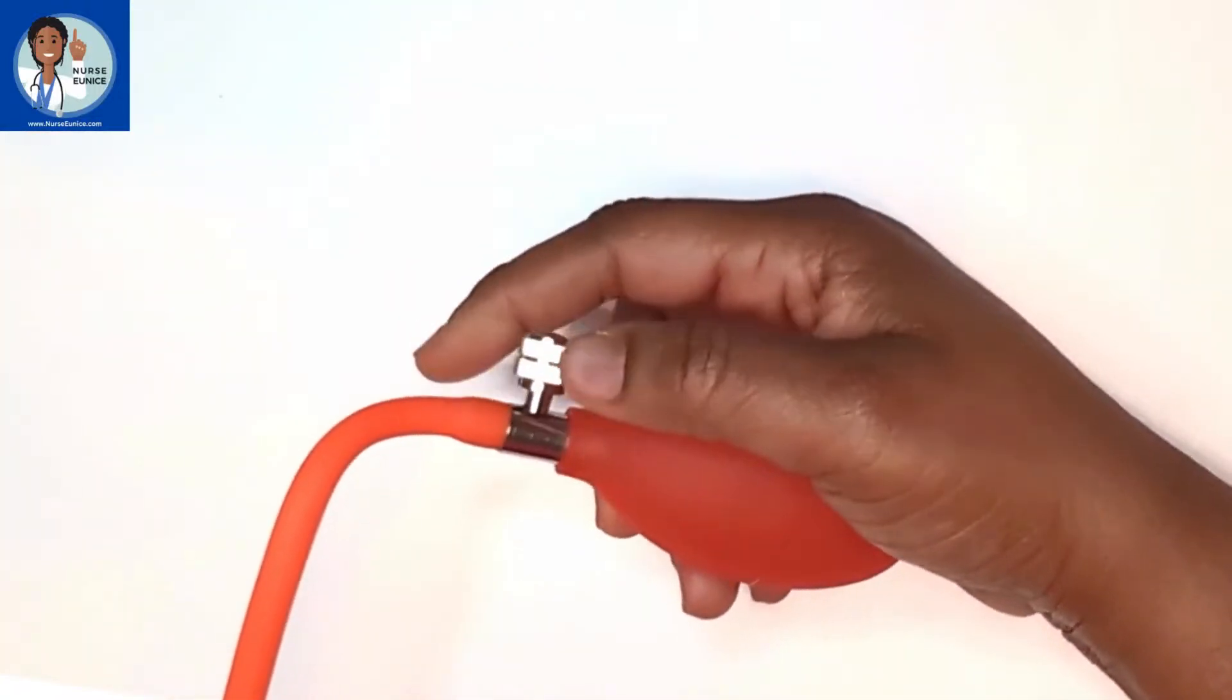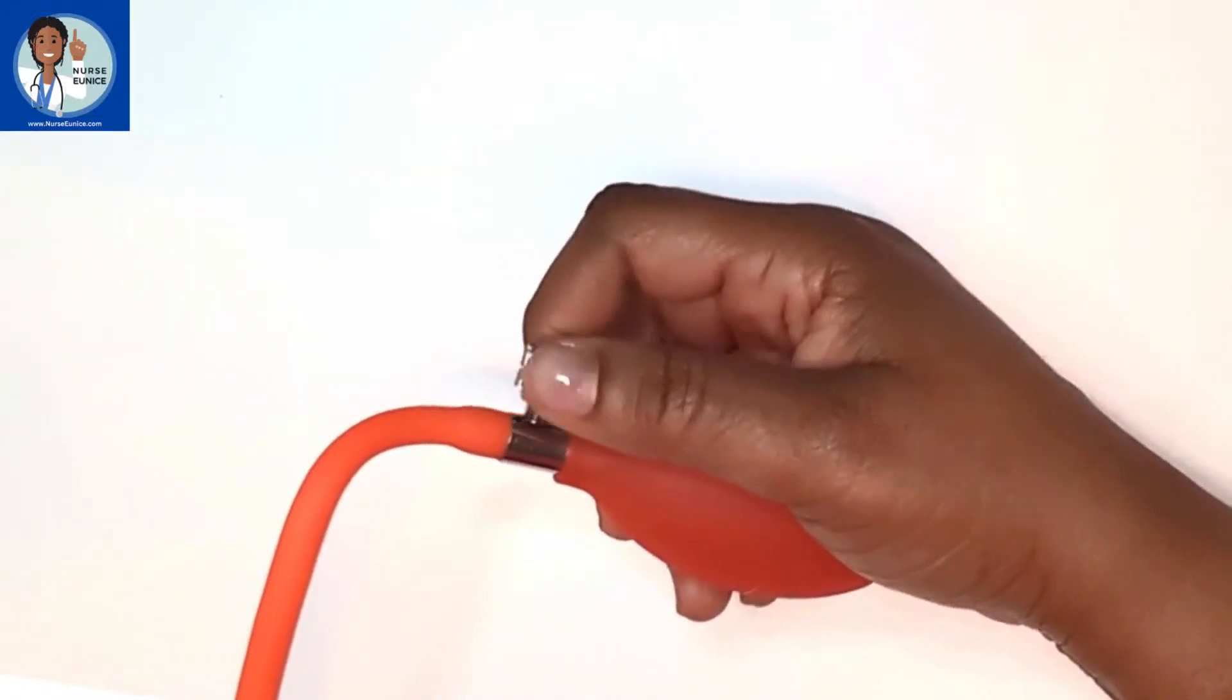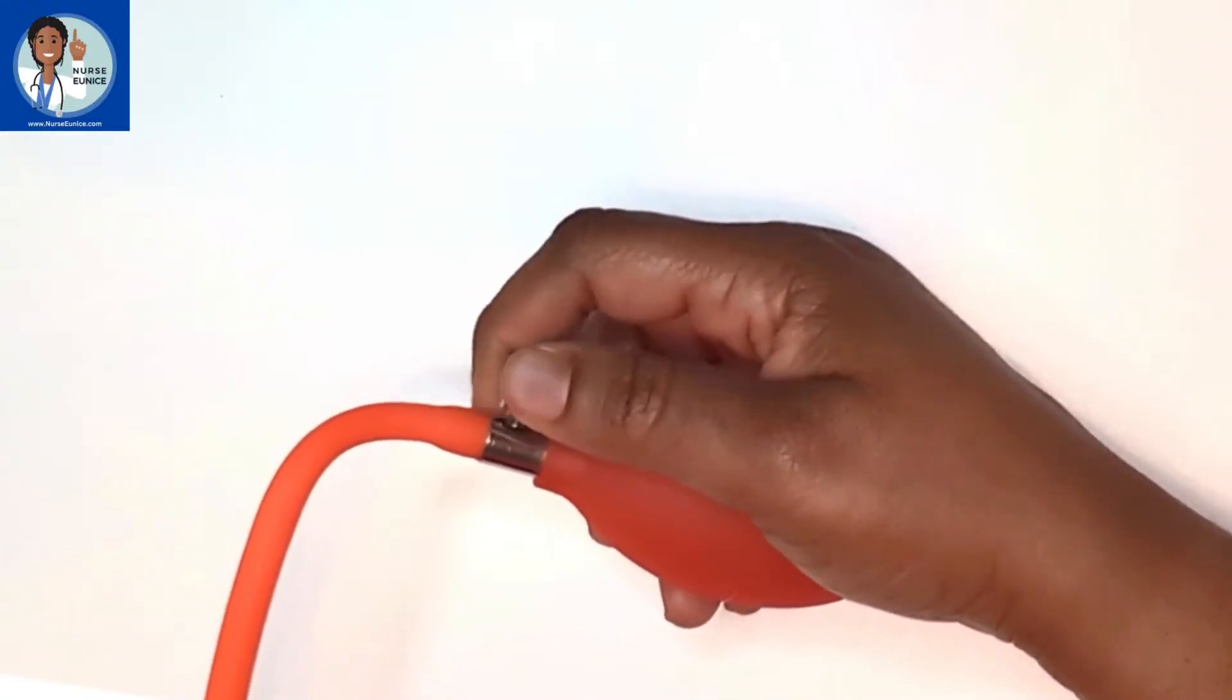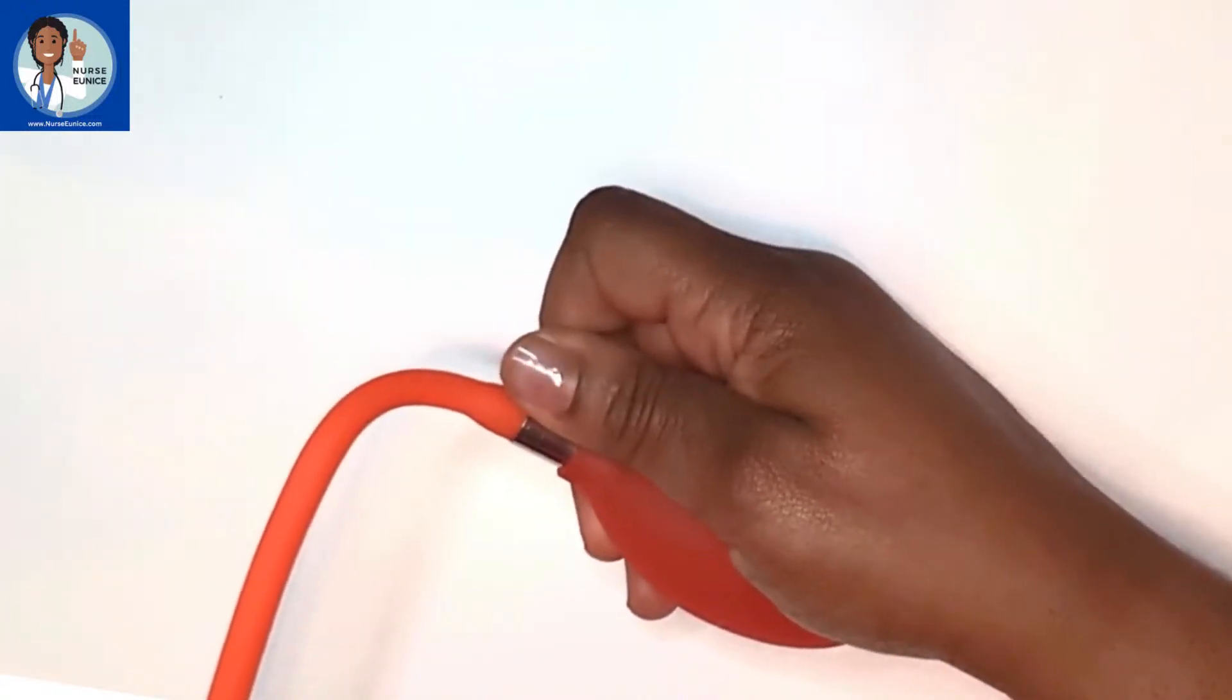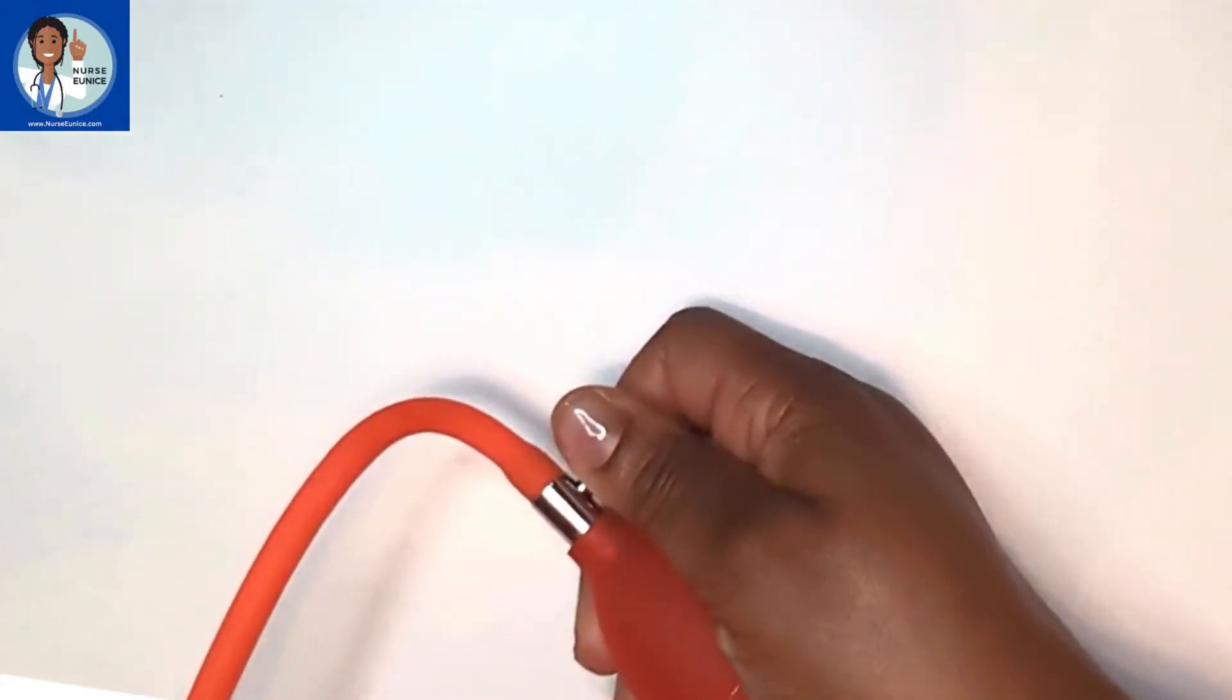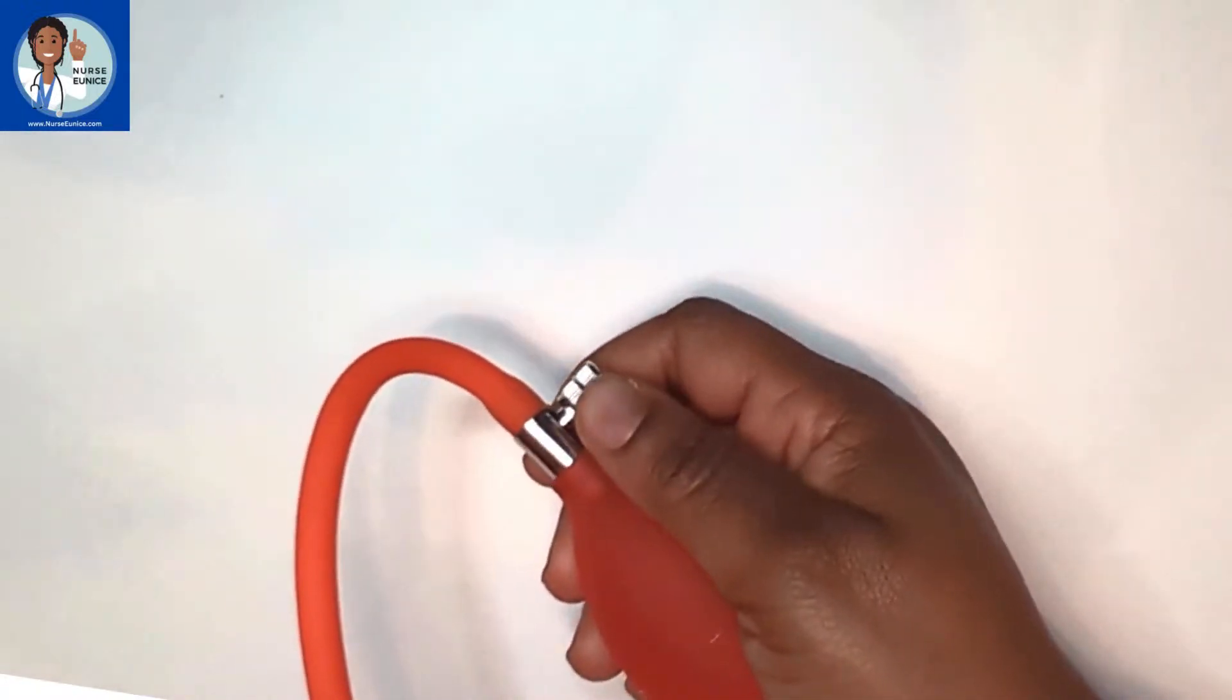We're going to tighten the air valve by turning it away from us. But don't tighten it so tightly to where you can't open it with two fingers. You'll know when it's closed because you won't be able to turn it any further. Don't make it so tight until you can't open it up with your two fingers. I like to keep two fingers on the air valve at all times. We have it closed.